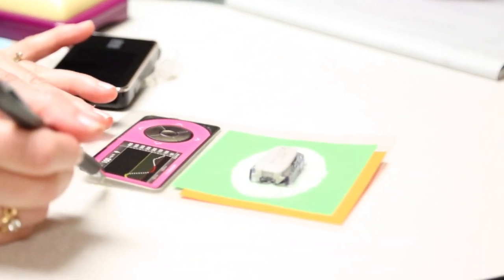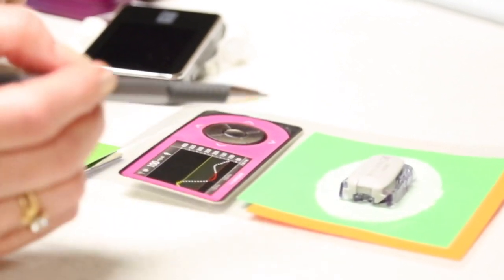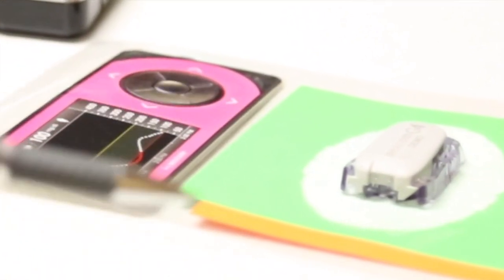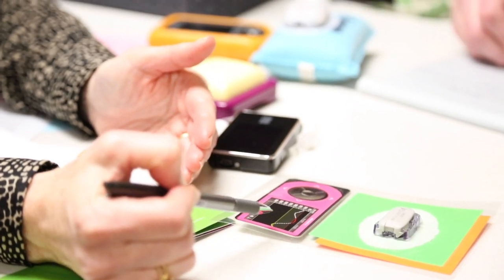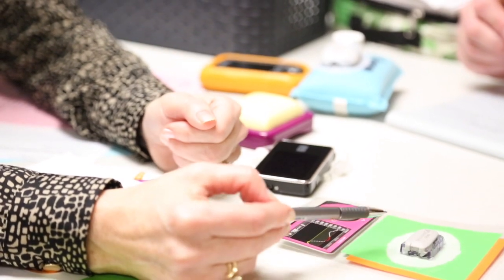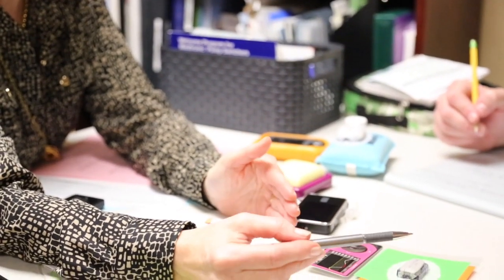It's FDA approved right now, the G5, so that you must check a blood sugar twice a day to calibrate it every 12 hours. So you might decide to do that at 7 o'clock in the morning and 7 o'clock at night. It can also give us great information on how to affect changes in his doses. Well, we see that every breakfast, he goes up and never really comes back to where he needs to be. Therefore, we need to give him more insulin for breakfast. Or he climbs all night long. He doesn't have enough basal insulin. We can change that segment.